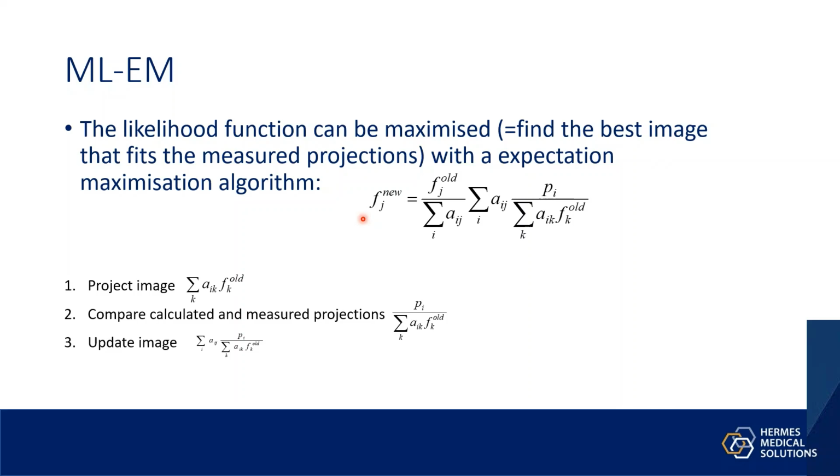And the cool thing about the MLEM algorithm is that it takes the Poisson noise, the distribution of the counts, implicitly into account.